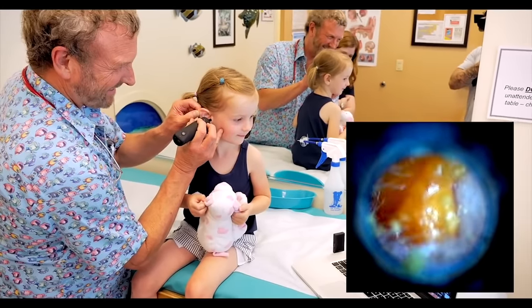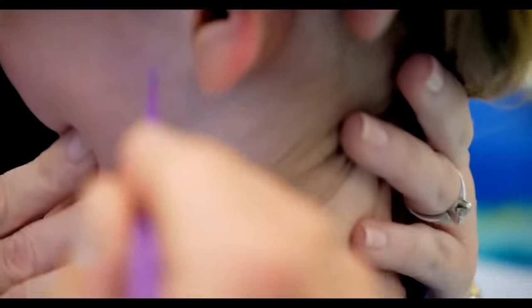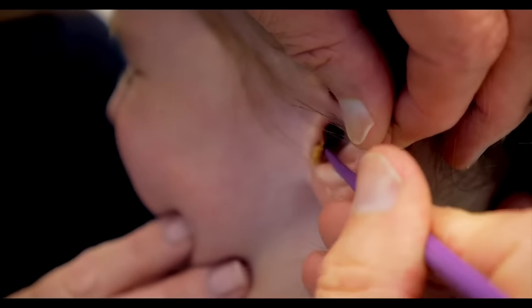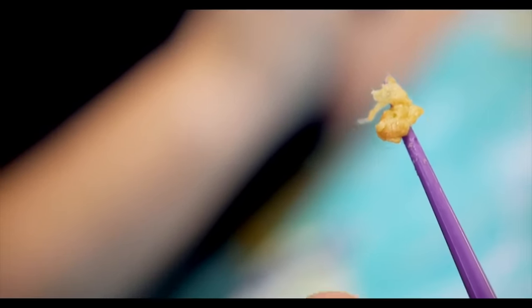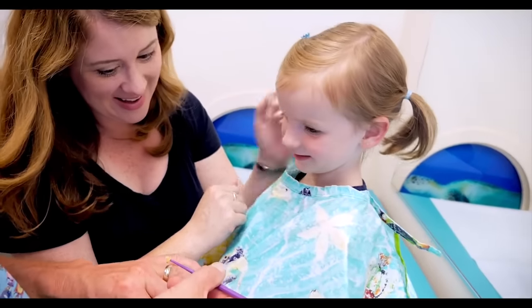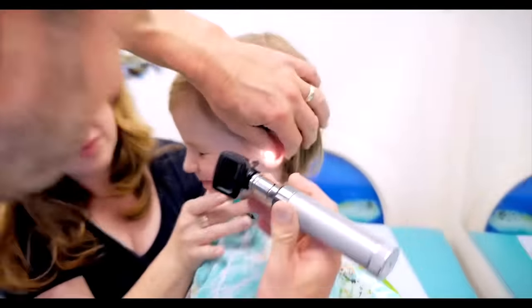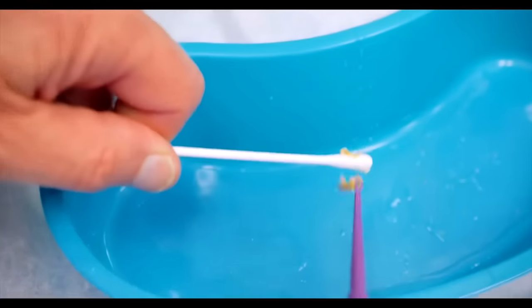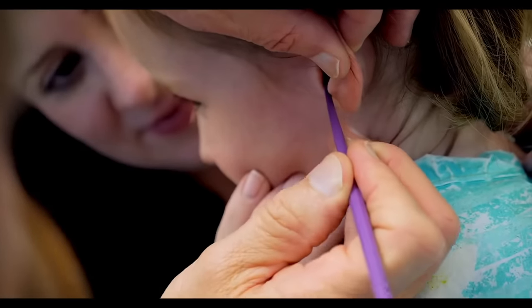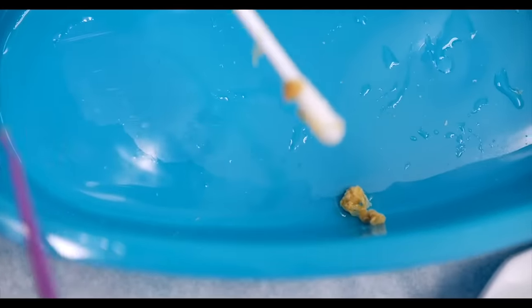Oh my goodness. That's one side — we'll go look at the other side. Oh, look at that — that's cool. So there is a big old chunk of wax. Oh my goodness, right there. How is that big thing in your little tiny ear, Patrice? Or that could be a gold nugget — we could make a little ring, like mom's ring. So get some of this extra old stuff off of there. We'll take a look. Oh, there's still more — it doesn't want to come off. Come on, wax. There it is — we've got some more. Oh, it's a stringer. You might be part B, because bees make wax.